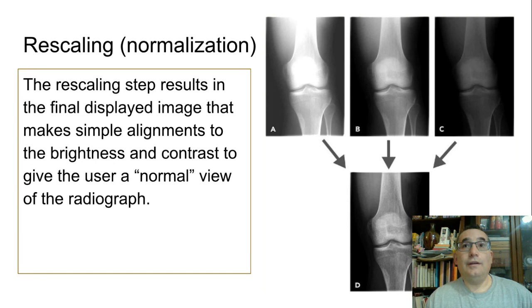So in an extremity, we were looking for a higher contrast, where, when we talked about the chest before, we were not, but we got it anyway. And also you're looking for a higher level of spatial resolution, where you don't want that so much on the chest, certainly not to the point that it becomes noisy. So we're left with this final image that is generally pleasing.